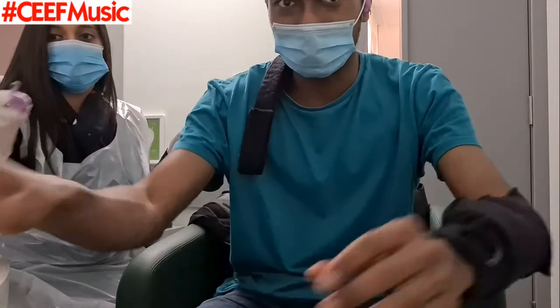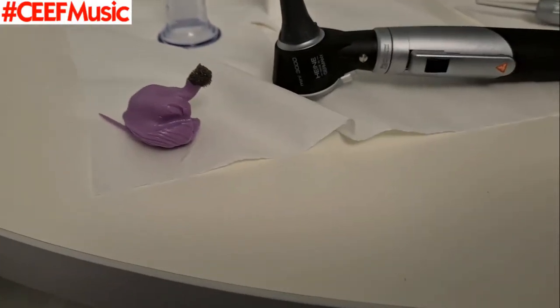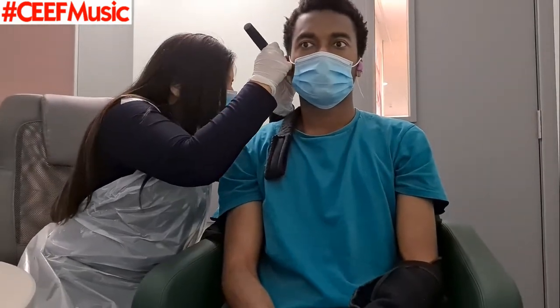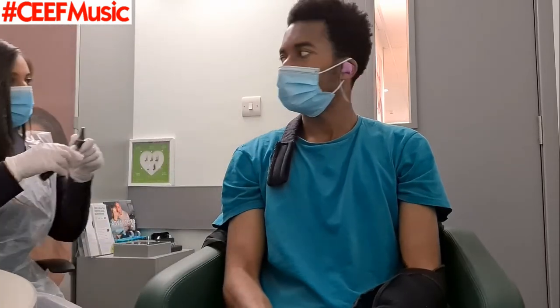I can't describe this feeling. I just thought to myself, let me show you guys — a little view of that. Nice little view. Nice little ear canal right there. And a final check — we've got to make sure that there's none of the substance left in my ears, and make sure the ears are still okay.